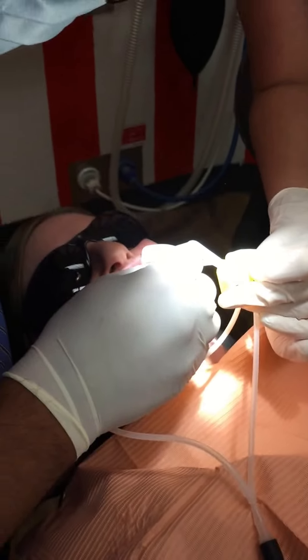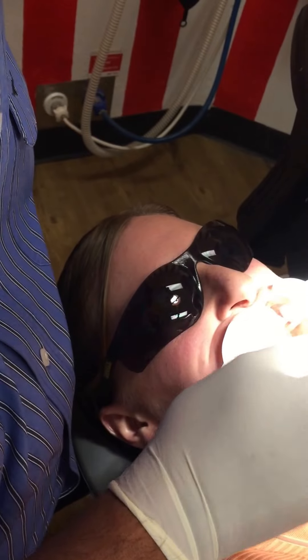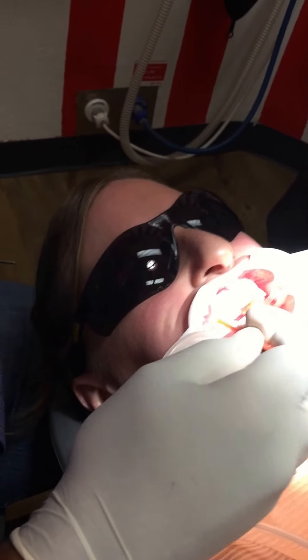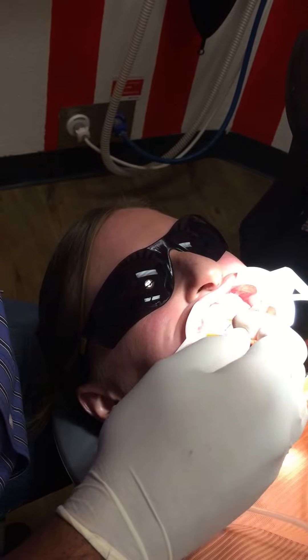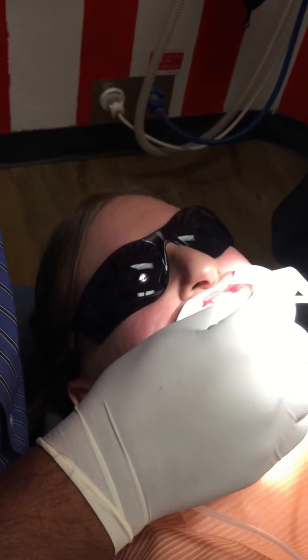So I just air dry all of the teeth and we apply some etch. I use a liquid clear etch to apply to the buccal surface of all of the teeth that I want to bond brackets to. The liquid clear etch wets the teeth very well, so it's a very good product. You only need about a drop to do the entire arch, or the entire two arches maybe a drop and a half. We'll just leave that in place now.